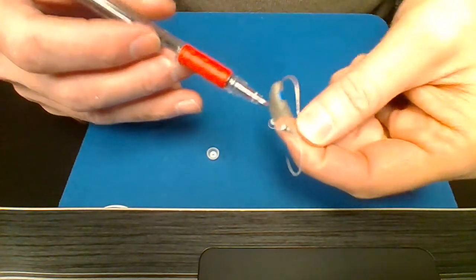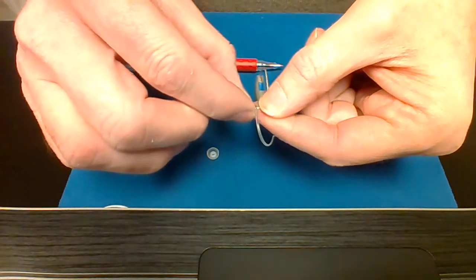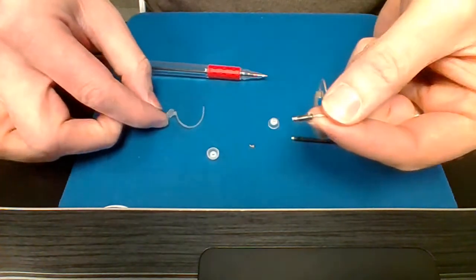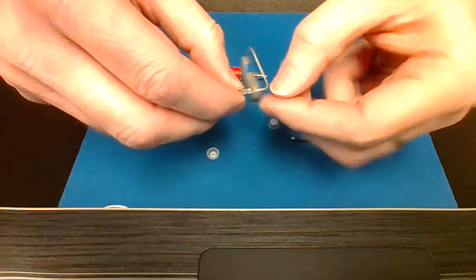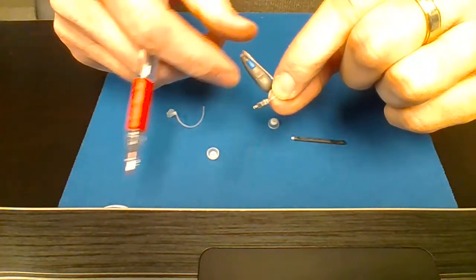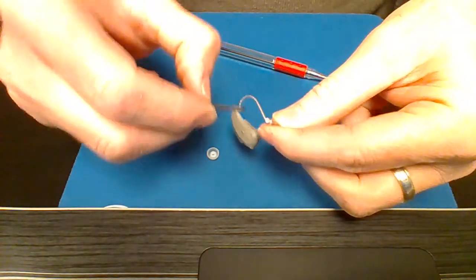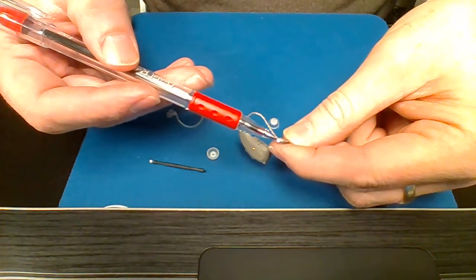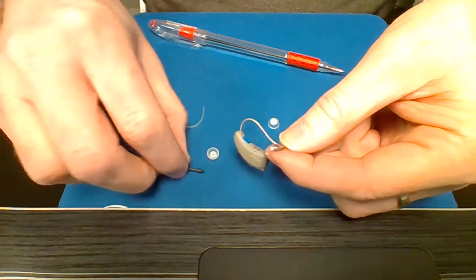Okay? Then we have the receiver here, and that's without the dome on it anymore. And then we take the old retention wire off. I had some debris fall off of there. Okay. And we have the old retention wire off. And now we just have the receiver, okay, with the wax filter in it. Now you look right in the end of the receiver, there's a little white tip there, and that little white tip is the wax filter.